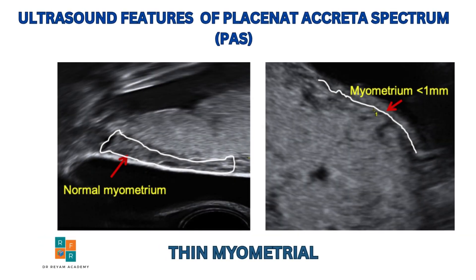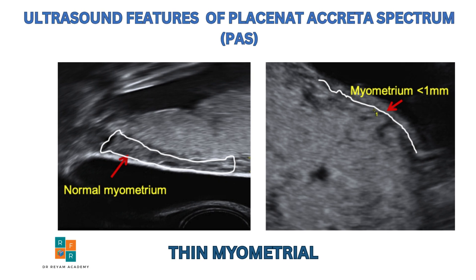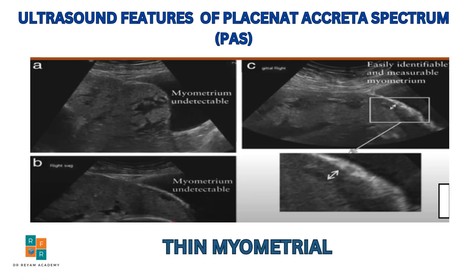The next feature is thinning or absence of the myometrium beneath the placenta. In this finding, the myometrial thickness measures less than one millimeter or becomes undetectable, and it is observed in approximately 50% of placenta accreta spectrum cases. These images clearly demonstrate the normal myometrial interface in cases of normal placental implantation, and the absence or undetectable myometrium in cases of placenta accreta spectrum.